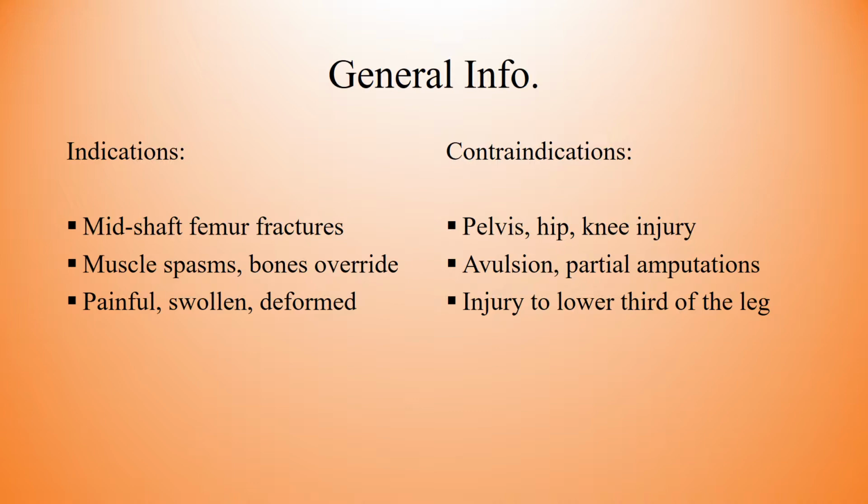A reason why femur fractures are so painful is that the large muscle groups in the thigh start to spasm, which also causes the bones to override. And there are also blood vessels and nerves that may be getting damaged in this process.